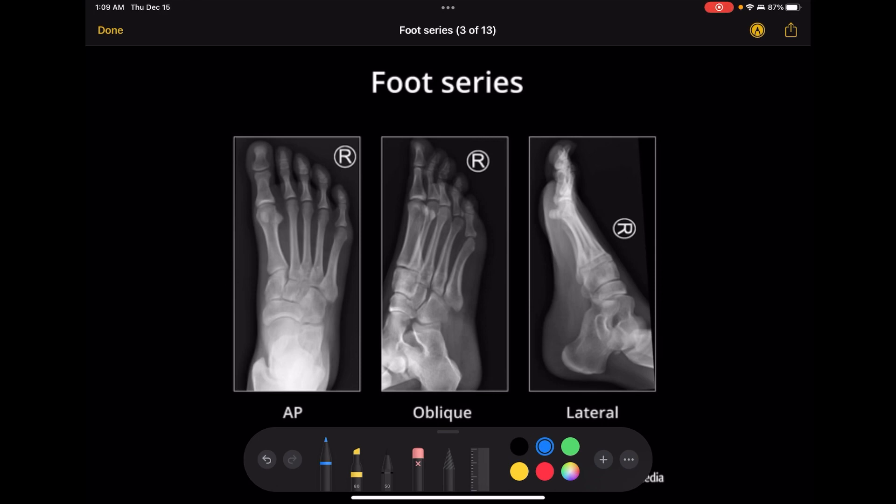One thing I noticed is if a patient has a steep arch, you kind of have to angle their foot a little bit more than you think. That helps to open up the joint spaces better if you have a steep arch. One of the things you really need to notice between the AP axial and the oblique is that the joint spaces here are way more open on the oblique — they kind of overlap on each other in the AP axial.